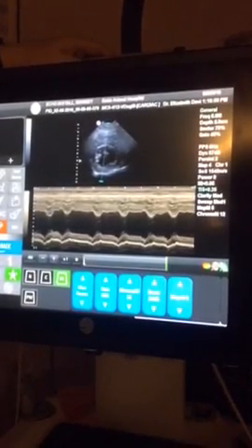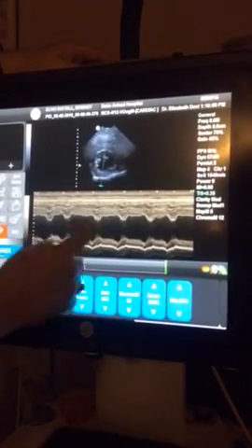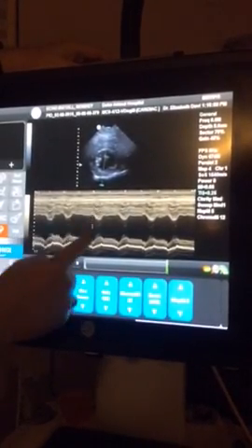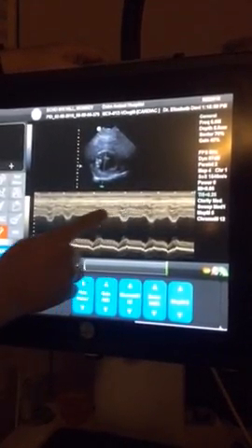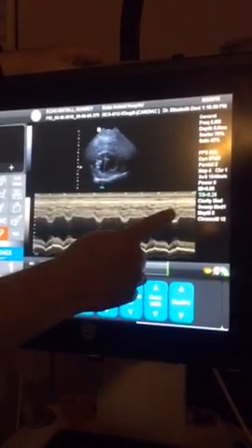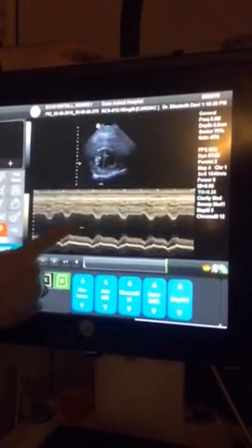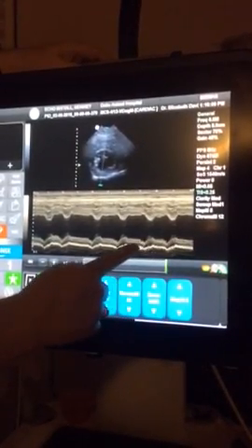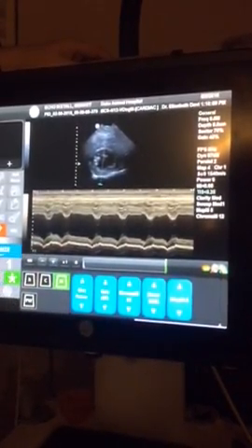Okay. So here, remember the humps that kiss in the middle is systole. The reverse curve right before that is diastole. The top wall right here is your interventricular septum inside the mushroom, and then the posterior wall of the mushroom. The pericardium is the white line below it.